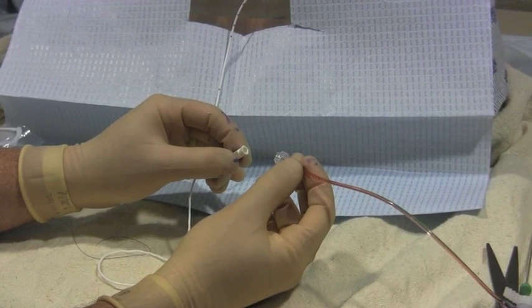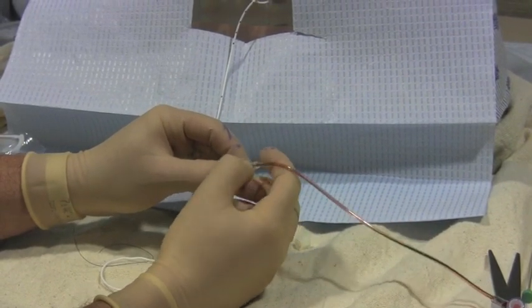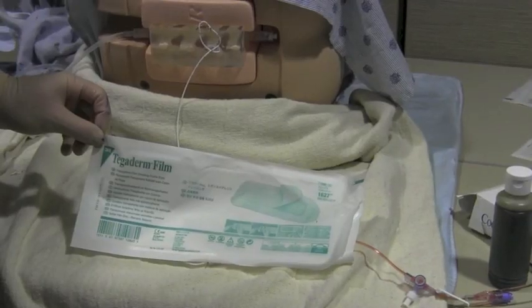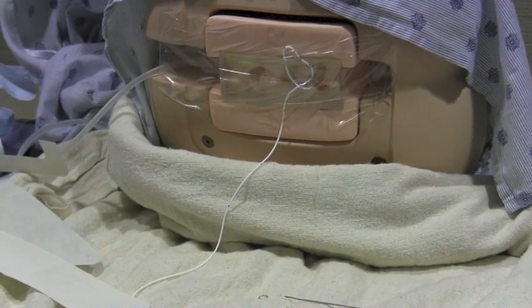Here we are connecting the lumbar drain catheter to the catheter tubing of the drainage system and collection system. A sterile clear dressing is applied and the procedure is completed.